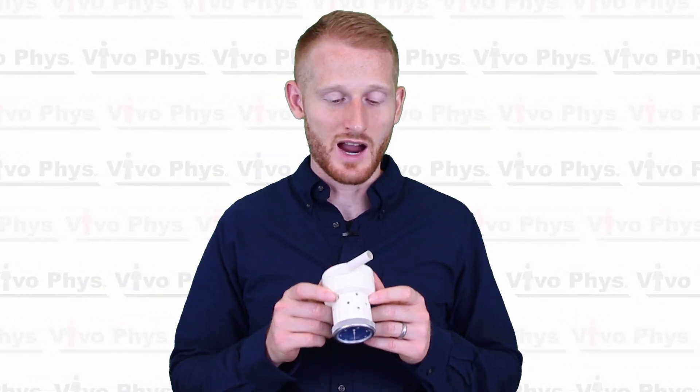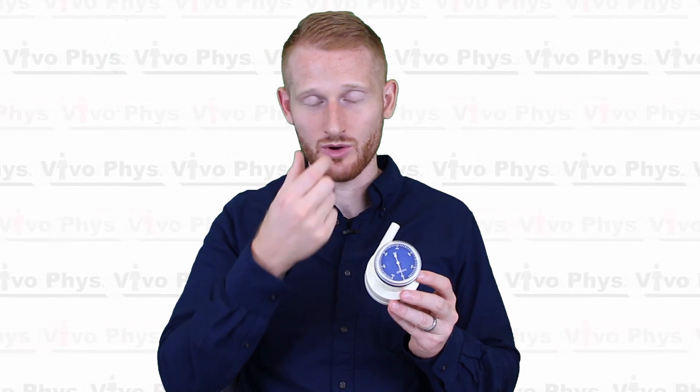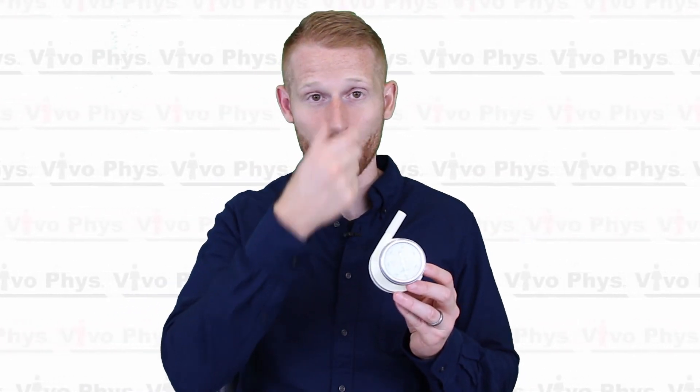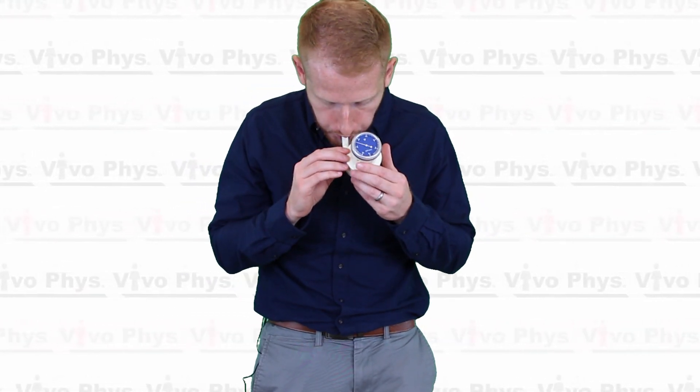When it comes to actually doing a trial, you're going to have the person stand up, seal their lips around the cardboard tube or the cleaned mouthpiece as best they can so no air escapes, and either plug their nose or use their hand to make sure no air comes out of the nose — you want all the air coming out of the mouth into the machine so it can be measured. They're going to blow into the device as hard as they can, as fast as they can, as long as they can.